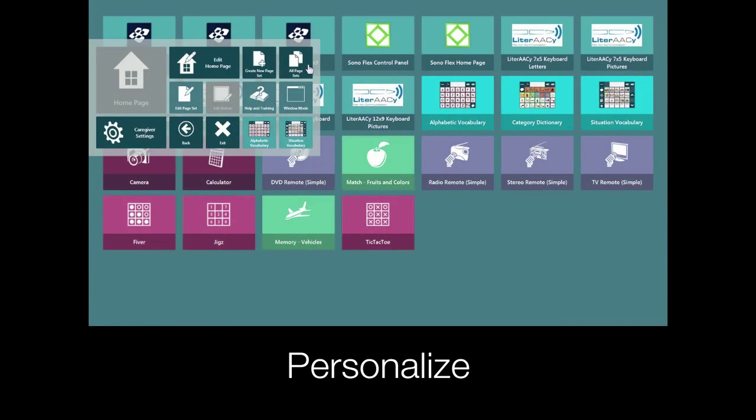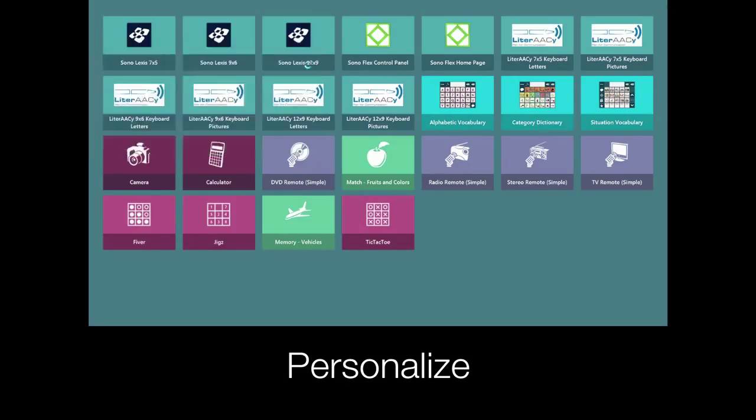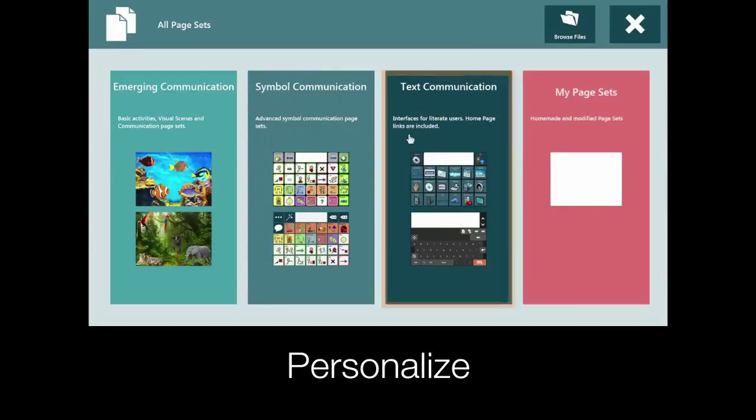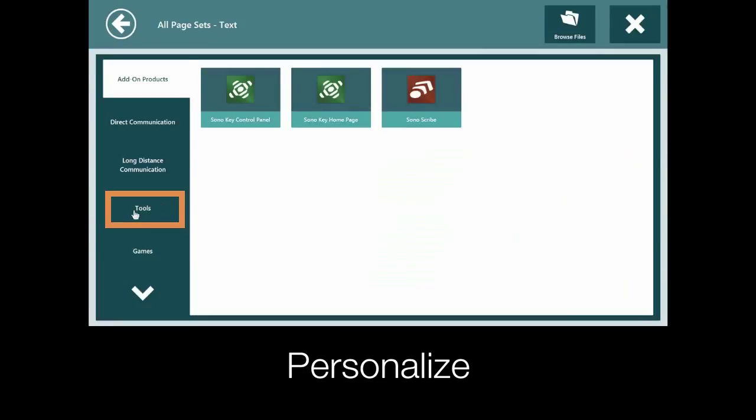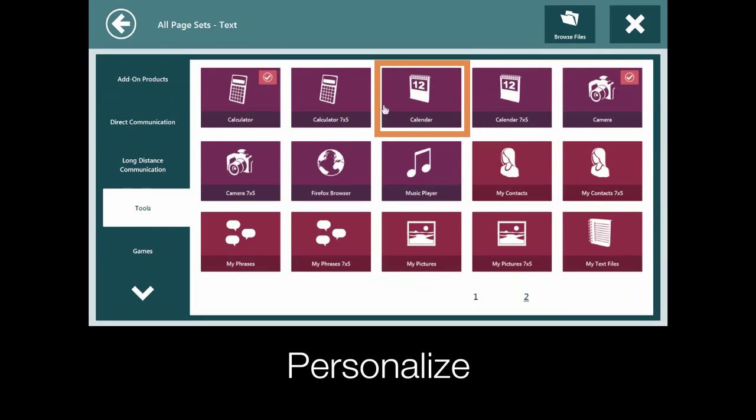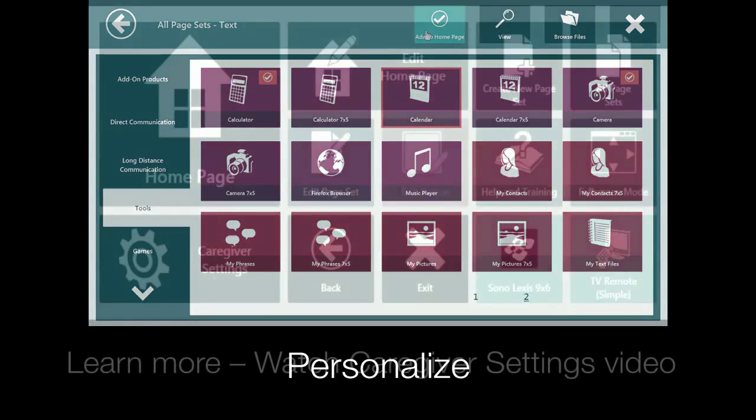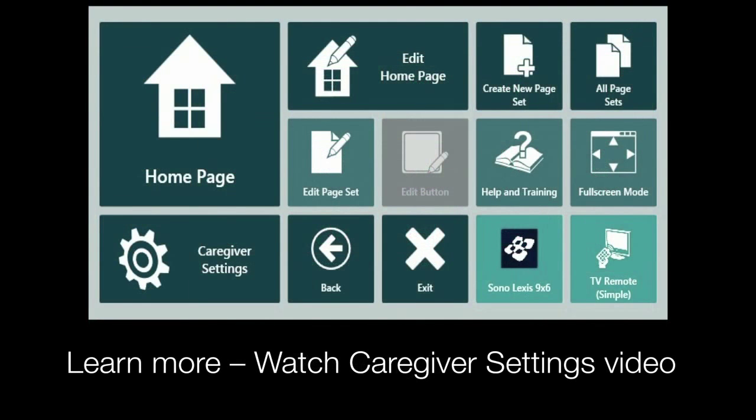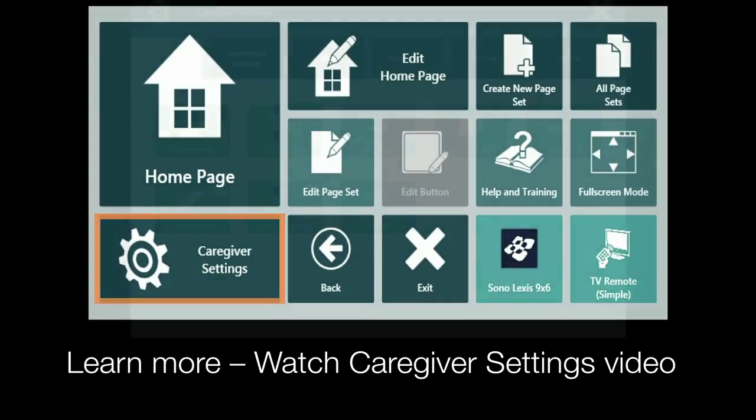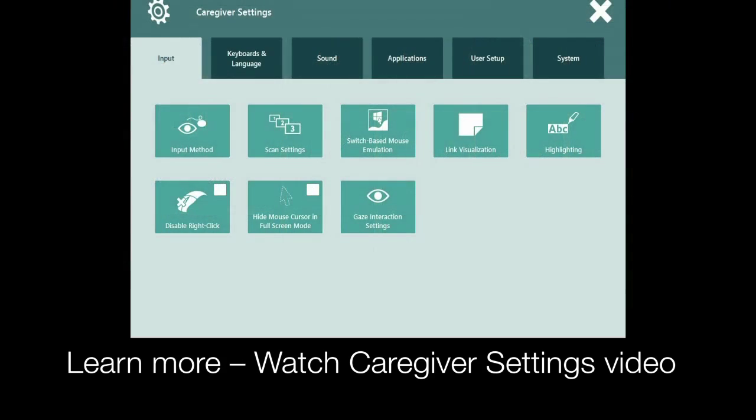Another way to personalize your user is to add additional page sets. This button lets you browse available page sets and add them to your home page. More customizations can be made in the caregiver settings like changing your voice and access method settings.